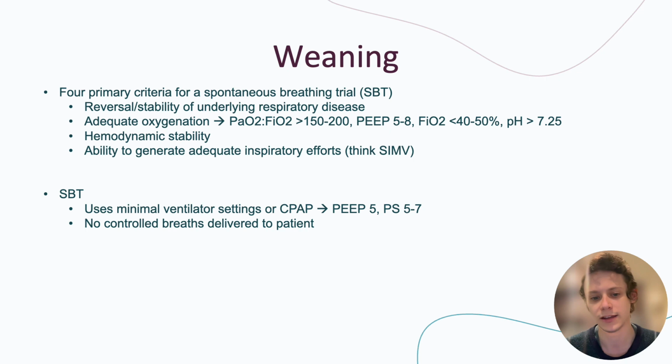So briefly, what is an SBT? An SBT is either a very minimal ventilator setting, or it's a CPAP, and I'll go into CPAP and BiPAP in a second. It uses minimal ventilator settings, so the PEEP's at 5, the pressure support's low at 5 to 7, because once again, you are breathing through an ET tube, so you need some pressure support. And there are no controlled breaths being delivered to the patient.